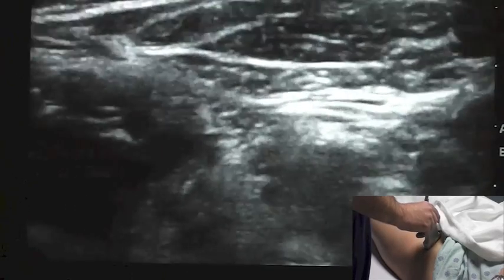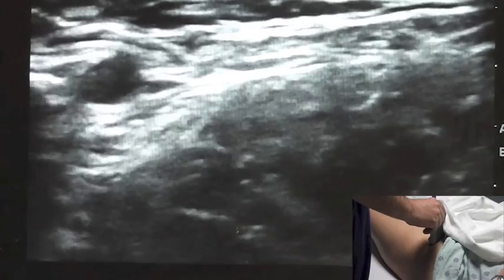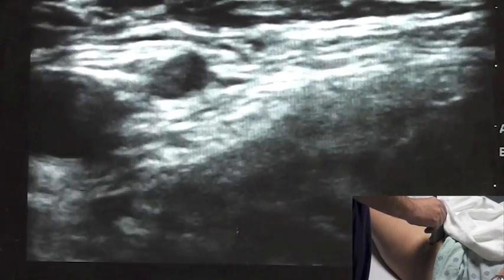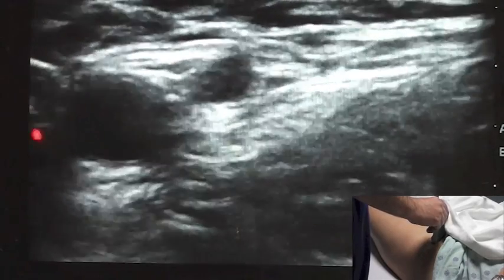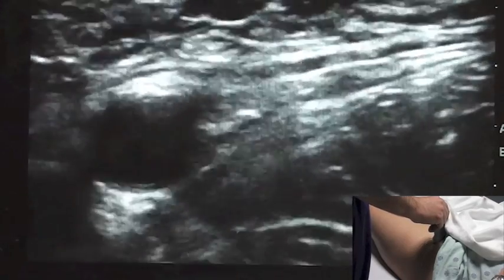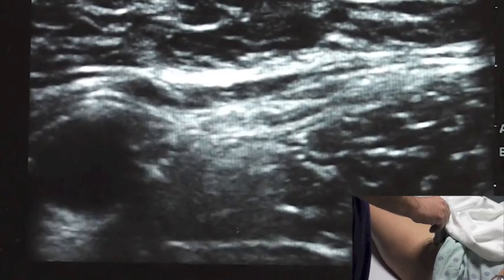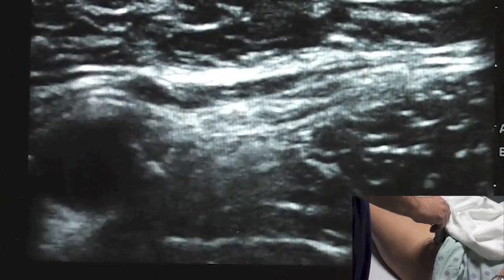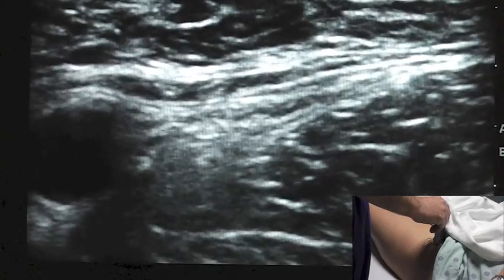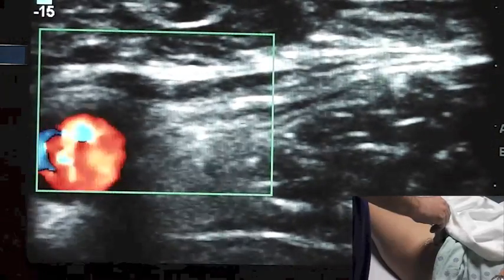As I scan medially, I'm very interested in finding the femoral vessels, which I'm starting to see come into the screen here. Having located my femoral vessels, I'm just going to scan upward a little bit. Here's our femoral artery, clearly visible in pulsatile fashion. We're going to do a little color Doppler flow through there just to confirm.